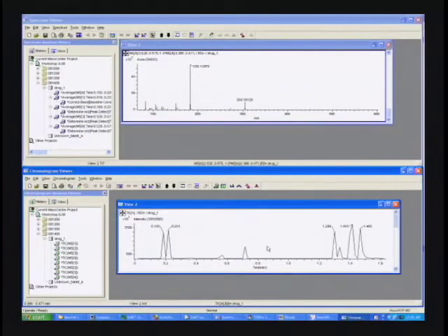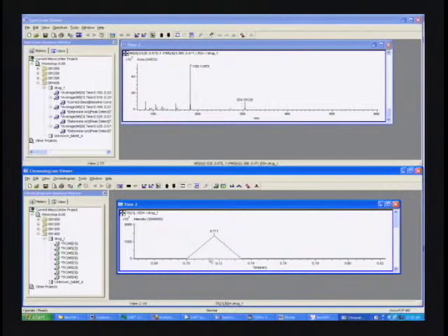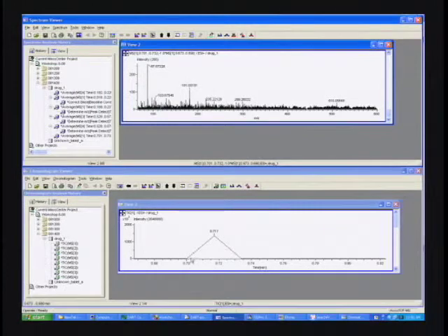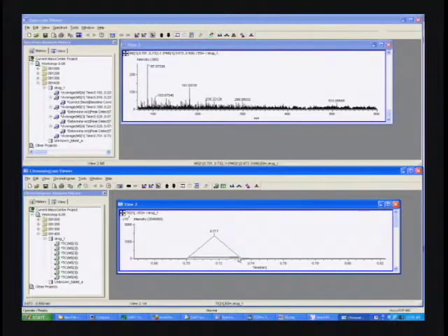Alright, so we're going to slide back up to our TIC1, and we're going to pull up a spectrum of cocaine, and I'll demonstrate how to lock the drift compensation to a cocaine spectrum. Now what I don't have is the mixture of cocaine, methamphetamine, and nifedipine that we use as our check standards to be able to show that the mass axis is in fact calibrated across the entire mass range.